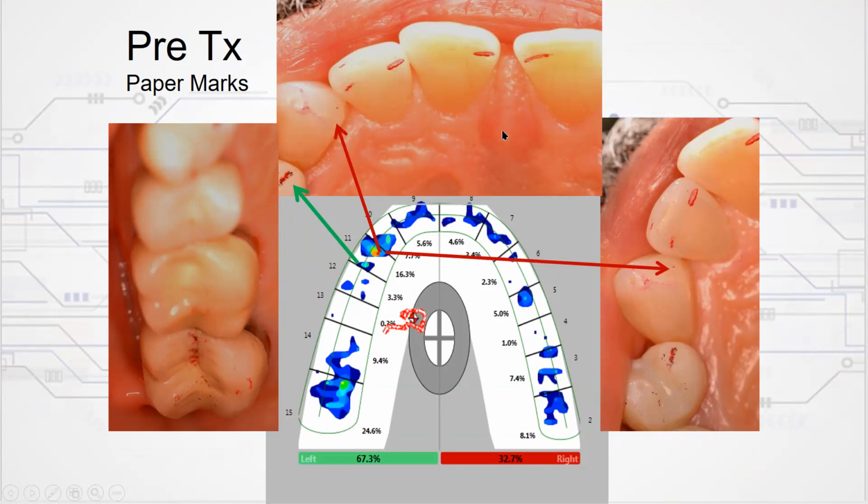And yet on the anterior teeth, there are very large marks, and you see they're all low force. And this is our problem in dentistry every day, every patient. What do the marks mean? What is their force profile? And how can I understand them, so I make intelligent choices about what to treat? It was very easy to know that this was the contact to treat, right? It's the high force contact. The others around it are all low force, and it rose too fast. So as soon as he brought his teeth together, he was hurting his canine with this very high force contact.